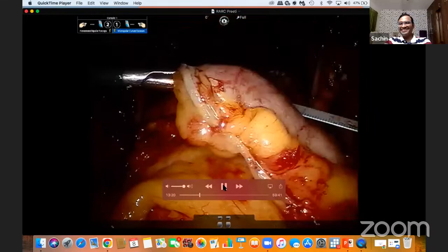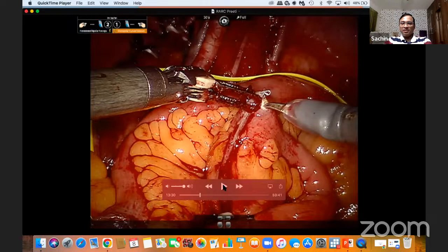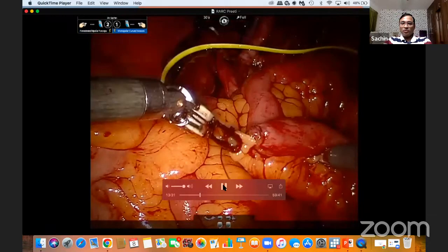So it's ileum, it works out. Another stitch is taken for the bowel, on which we are doing an enterostomy. I put a small mark for the distal end of the conduit, which is going to come out of the anterior abdominal wall, and keep it just like that. So now the enterostomy is done side to side.